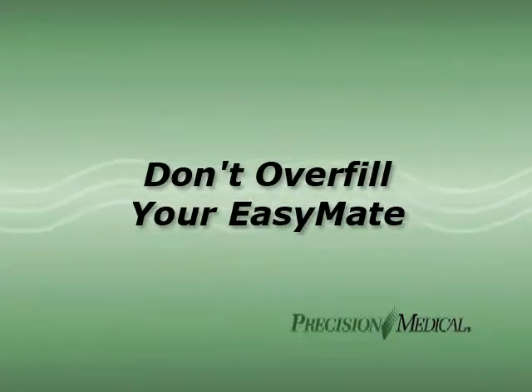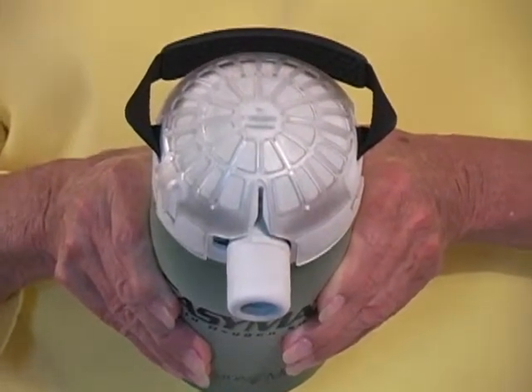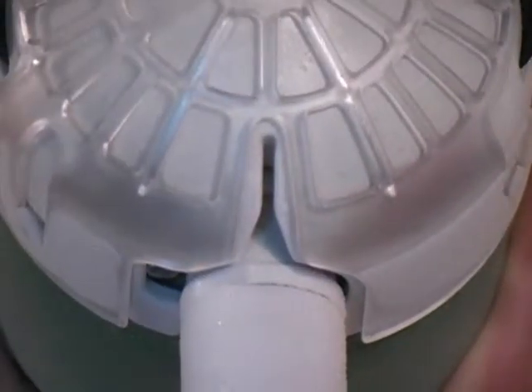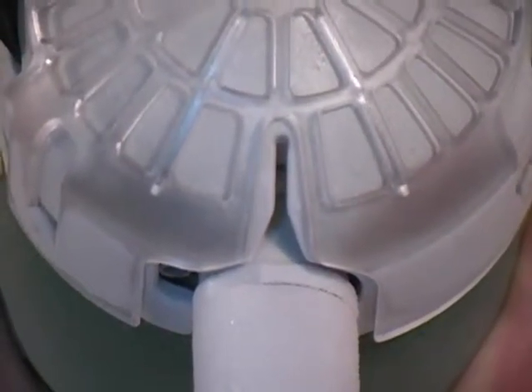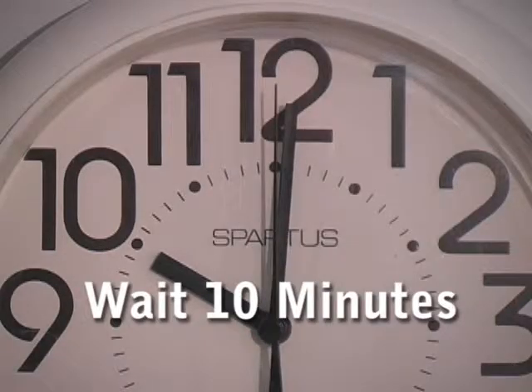Never fill your portable unit for over 30 seconds. That will cause overfill problems, such as a half hour delay before it can be used. Frost on the unit cap is a sign of overfilling. If you overfill your unit by mistake, set the pulse selector to zero and let it stand for 10 minutes.